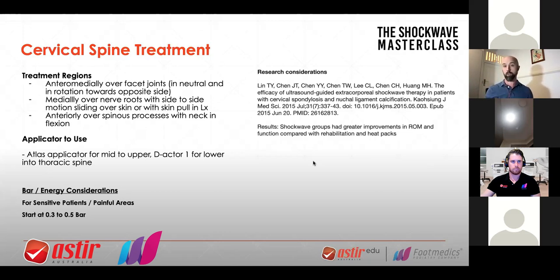So when I go to the right, it hurts, it gets guarded and painful. I can apply the shockwave at a very low bar — and this is why we've mentioned low bar, low intensity, low pressure — because we want to make sure that we're going in soft and gentle. We don't want to increase their pain. We want to just increase their range of motion. That's the number one aim, and that often results in less pain. If we can do that at a low grade without having to increase the force, then we're doing things in a very efficient and elegant way of doing it. You don't have to go in hard.